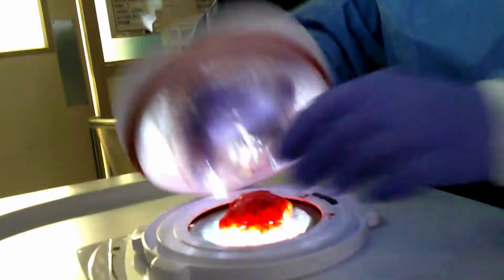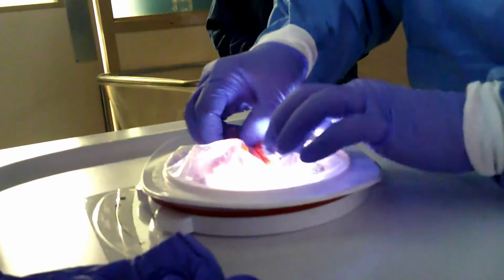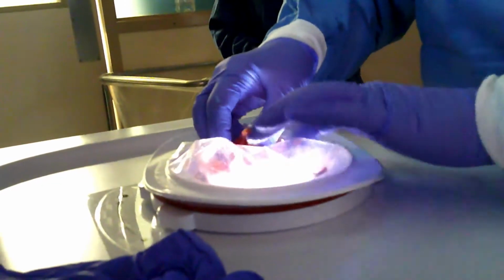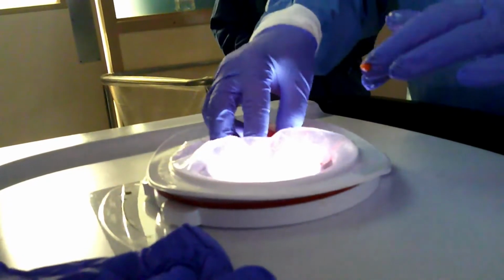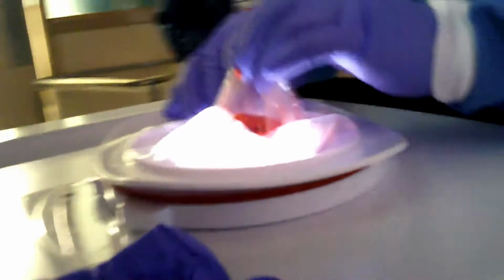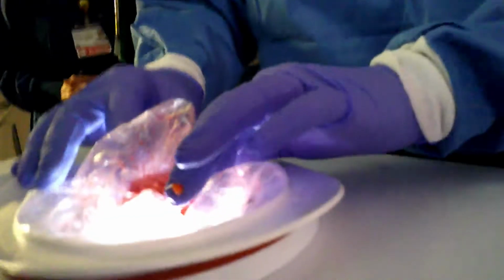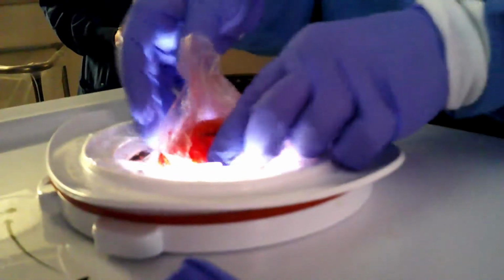Placing the markers in, I choose to put silk sutures in the specimen before I even remove it from the patient. So as I'm dissecting the margins, I do a short silk superior and a long silk lateral. That way, before I ink the specimen, which I will do after the fact, once all the imaging is done, I'm able to tell what's what.